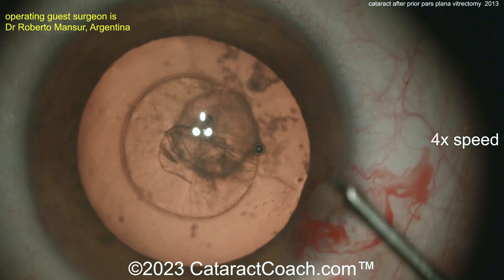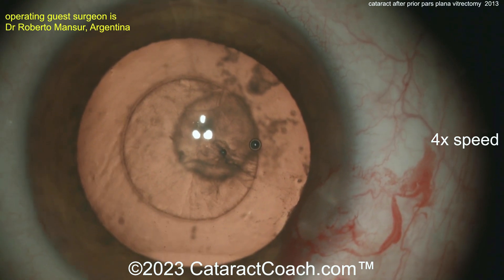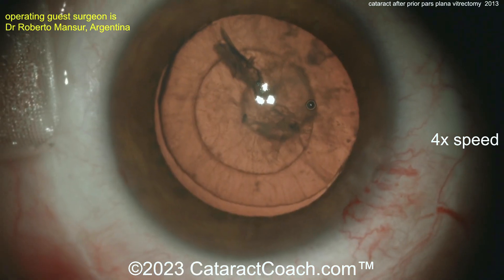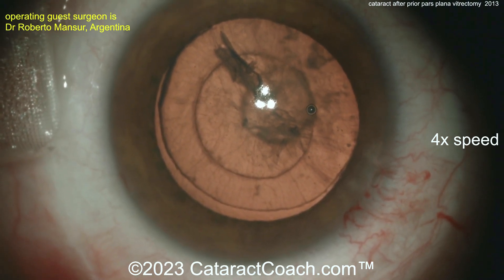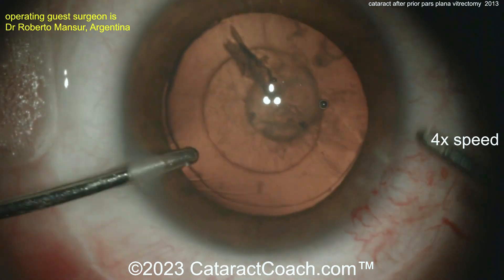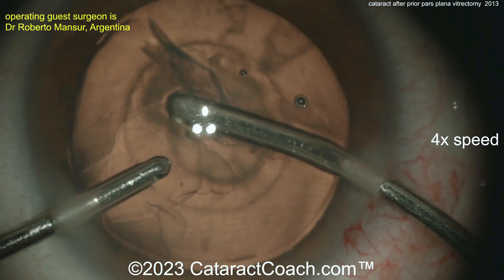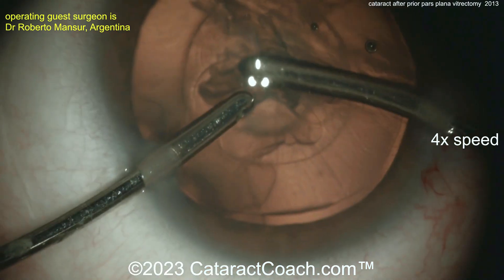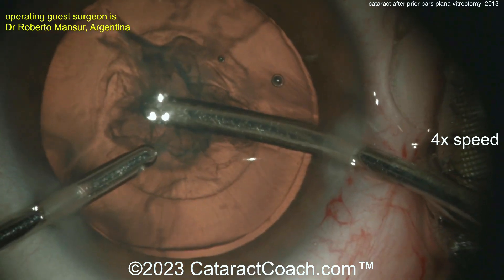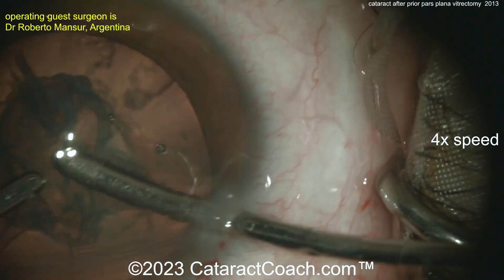The rhexis is done here. How do you do this case? You do have to treat this case differently. Very, very gentle, minimal hydrodissection — I'd actually focus just on hydrodelineation. You basically want to treat this case as if the patient had a posterior polar cataract, because that site of the opacity on the posterior pole of the lens could be damage to the capsule. It may even be partially perforated, but certainly the capsule in that one area is weak.